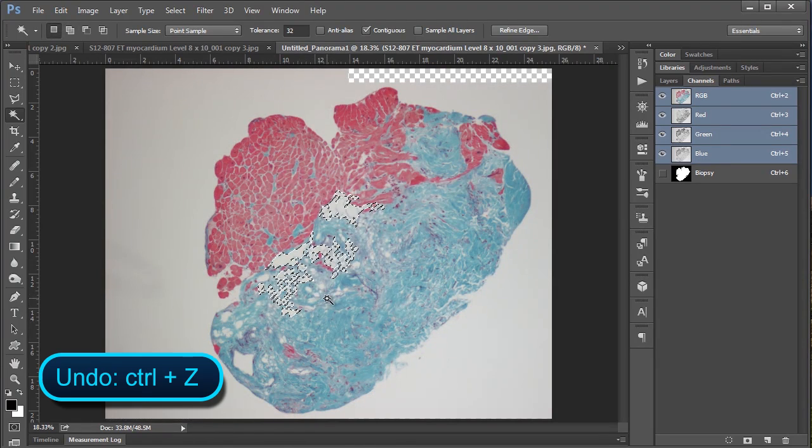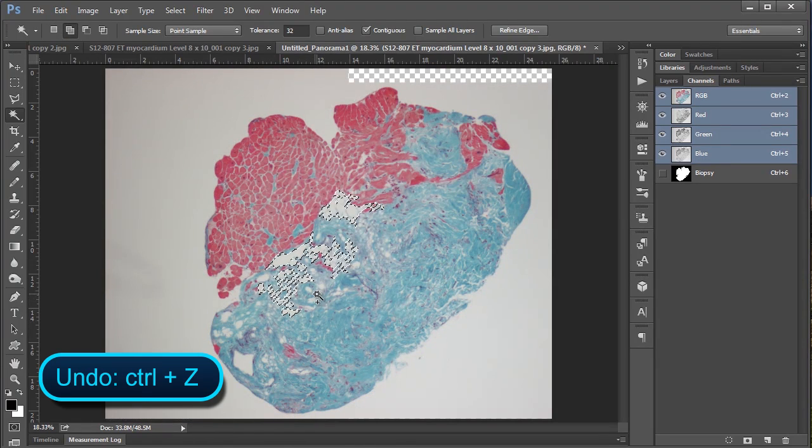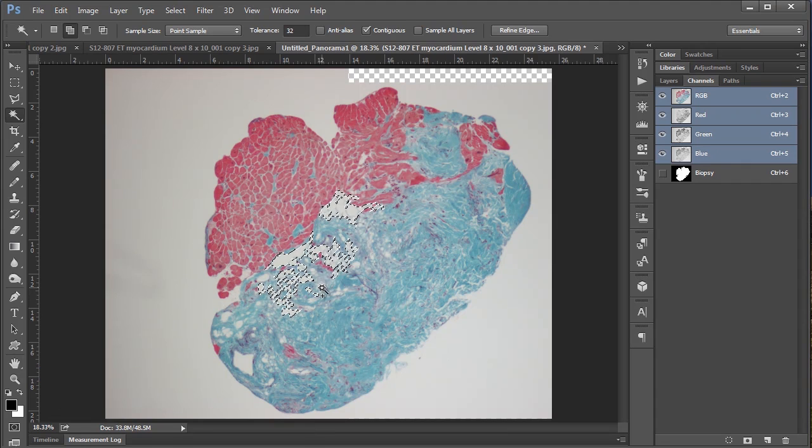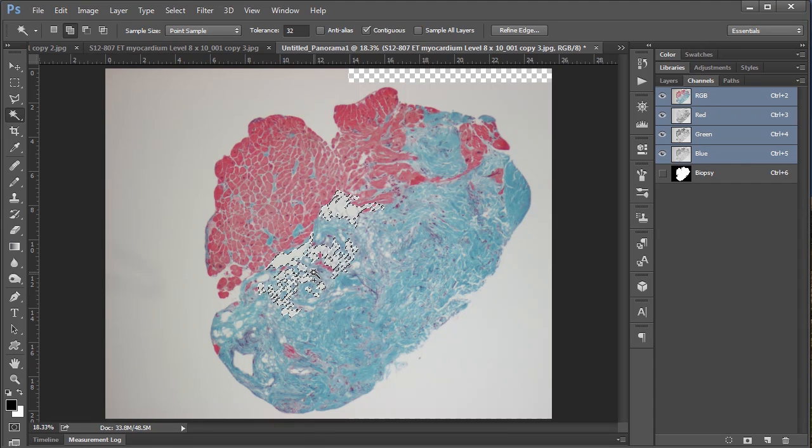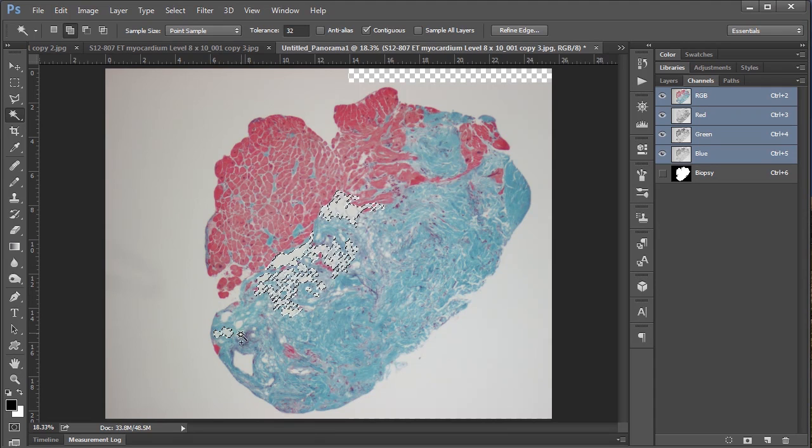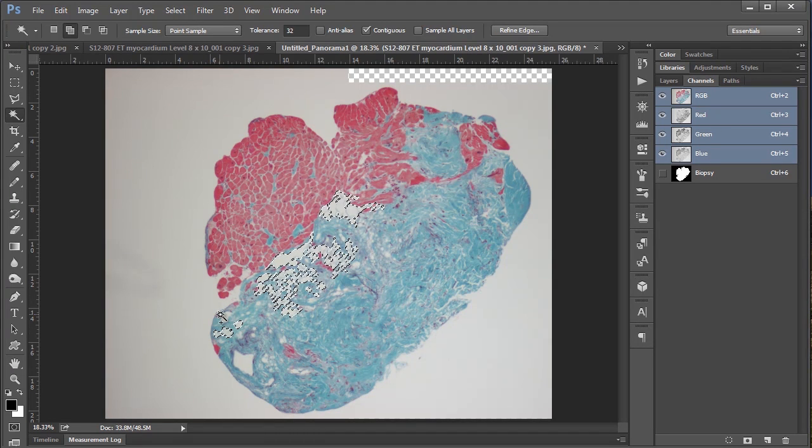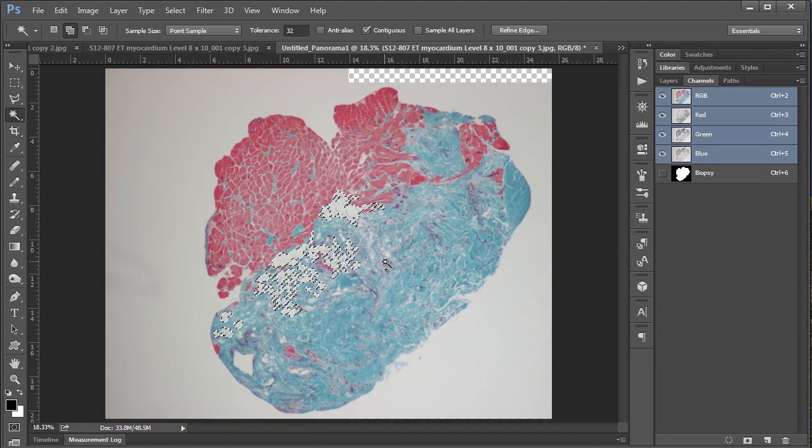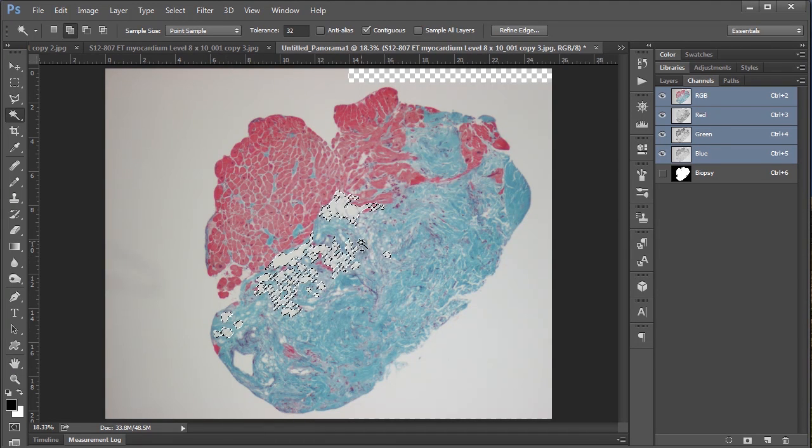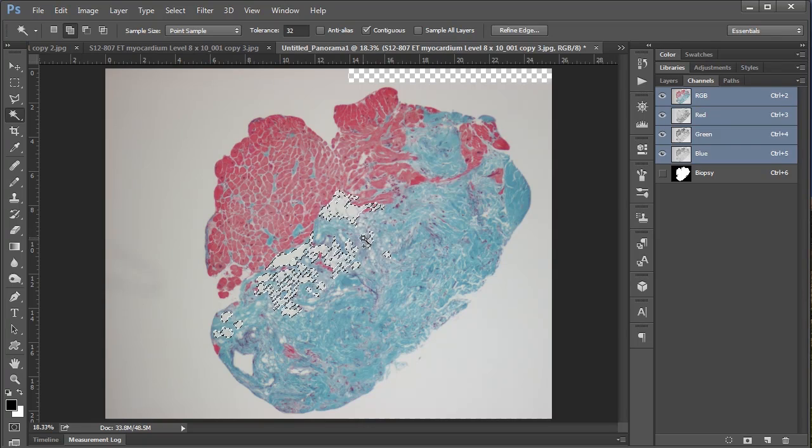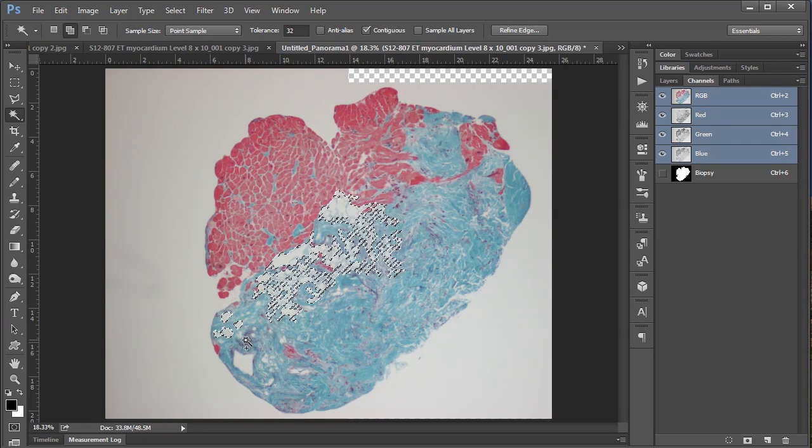So it is slightly, whoopsie daisy, I'm going to hit control Z to undo that. It is a little painstaking to go through and select these kind of by hand, but ultimately it doesn't take too much time. So I'm just going to select most as best I can here. Yeah that looks pretty good to me. I'm sure I'm probably missing some somewhere.